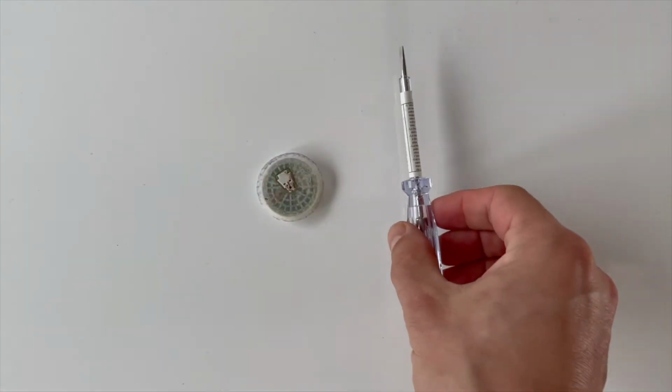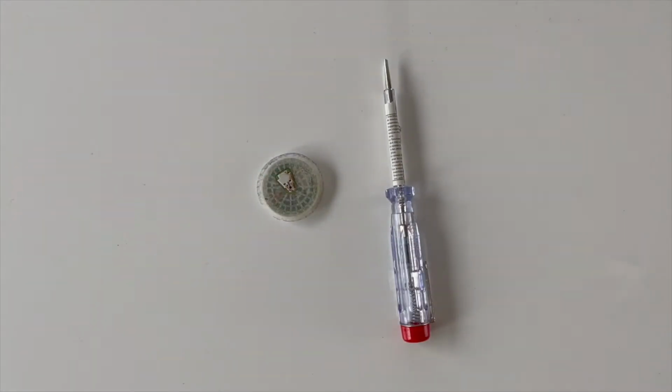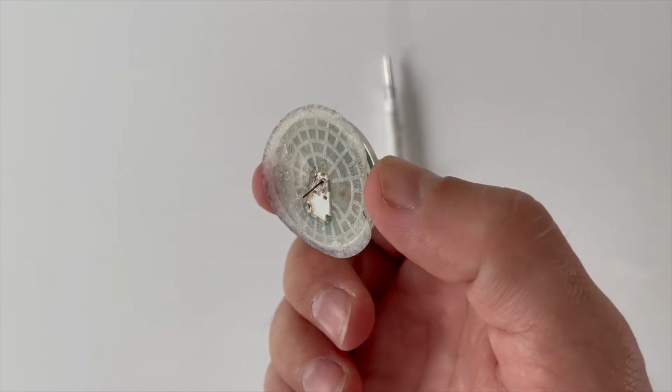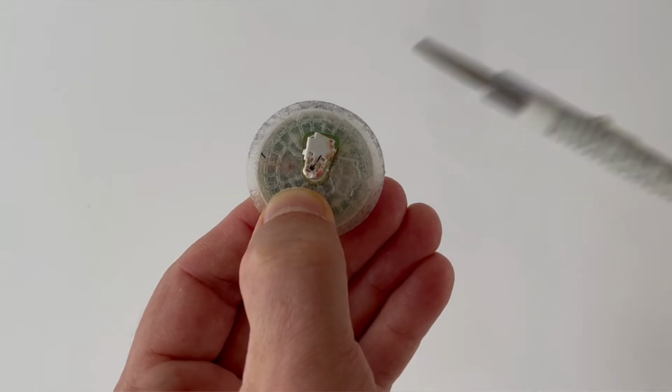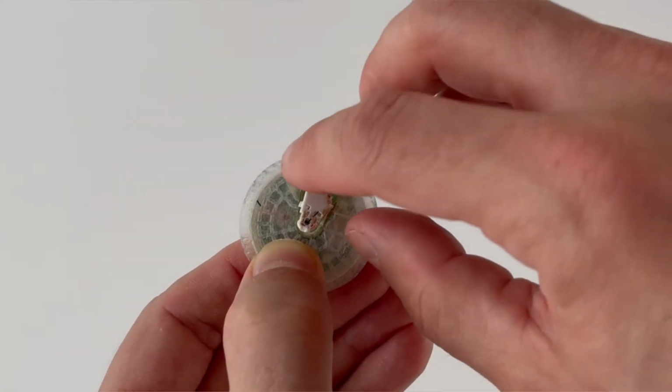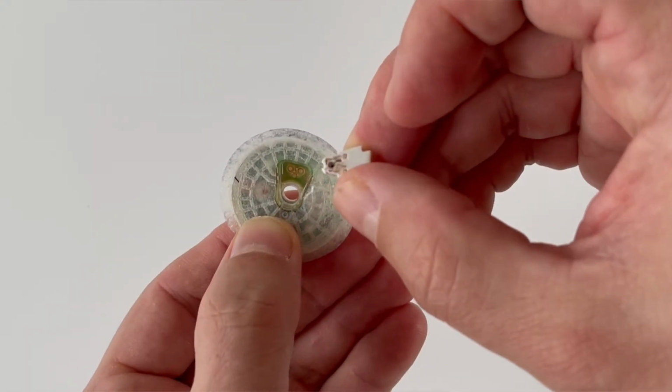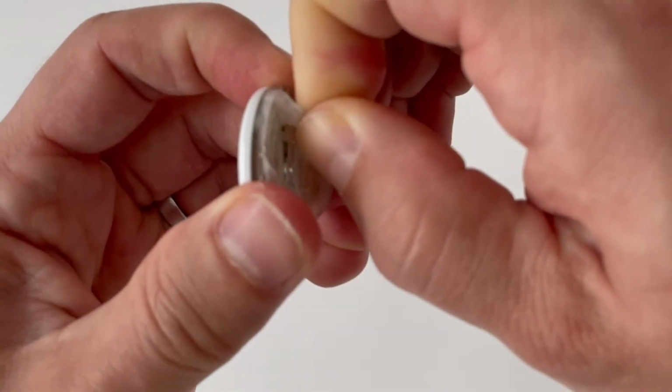Now I thought you might want to know what to do and how to recycle the used sensor as well. So here it is. Again, very simple. You just need the used sensor and a small screwdriver. One part of the sensor is the tiny filament that is under your skin, and we can easily remove the part with the filament using a screwdriver. Although this part is not very sharp, I believe it should still go to the sharps container. And then we're left with the sensor and the adhesive.